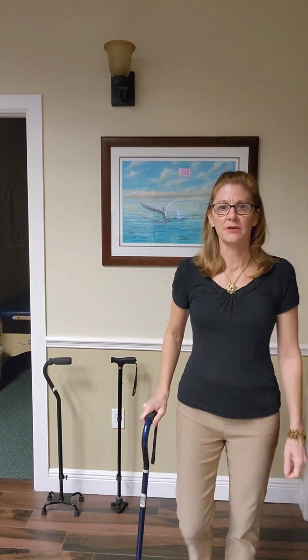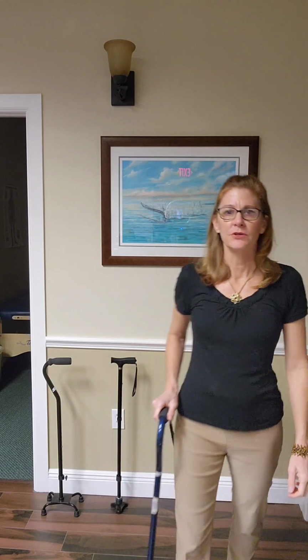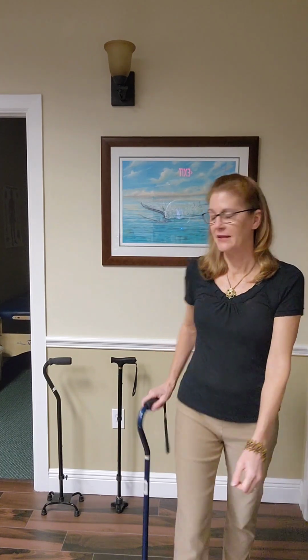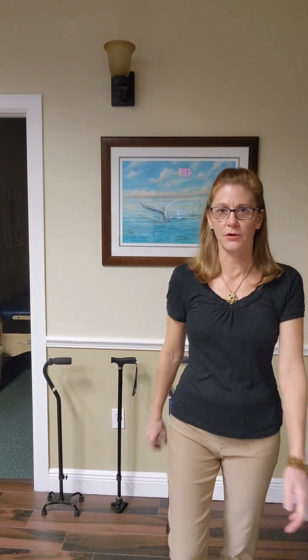So with this cane, I just tell people when you walk with it, just tap it down rhythmically as you go. Don't think, turn your brain off. Let the natural stuff happen for you. Just touch it down naturally. And typically, when you get into a rhythm and you just go with what your body wants to do naturally, it will happen correctly. That the cane will go with the opposite foot. Because that's what happens when we walk without a device. The right arm goes forward with the left leg. That's that natural arm swing we were talking about. The left arm goes with the right leg.